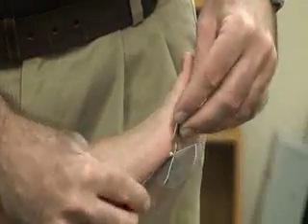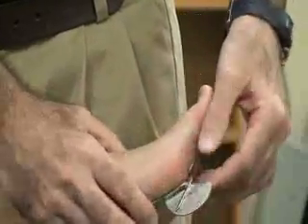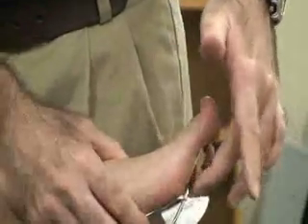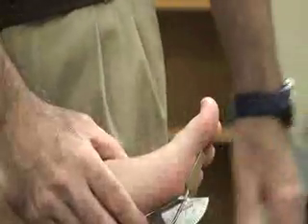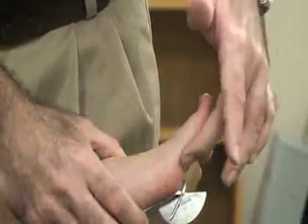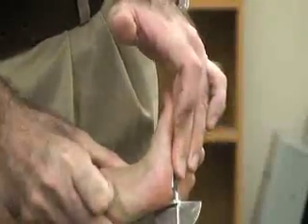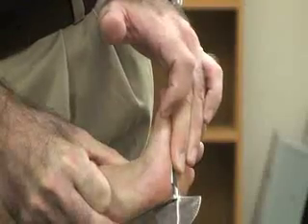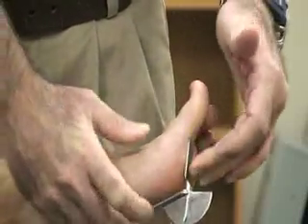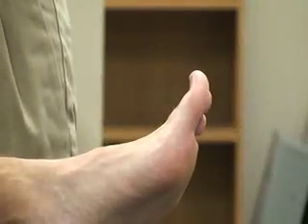Likewise, we can use the metal or dorsal goniometer — this time it's going to go on the plantar surface of the foot. The fulcrum is going to be in the center of the metatarsal phalangeal joint for the joint being tested. The moving arm is going to be on the proximal phalanx, and then we're going to pull back into extension as much as possible. The reading again is 70 degrees for the first digit and 40 degrees for digits 2 through 5.